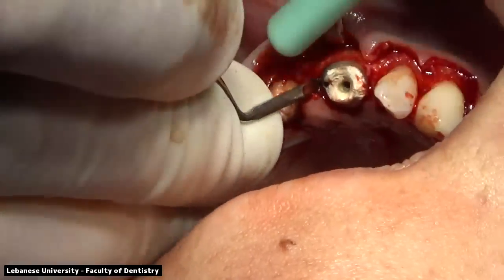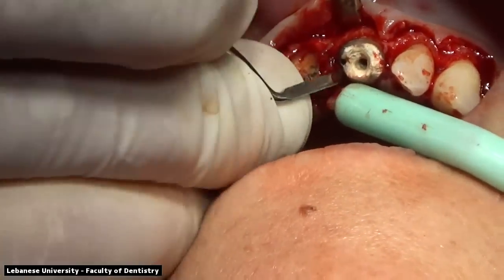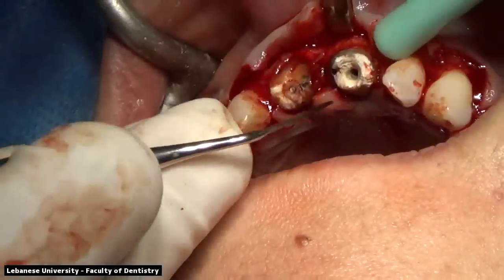The importance of the periotome is to remove any soft tissue adherences and any periodontal tissue attachments all the way to the apex of the root, so that we do not use too much pressure on the buccal and the palatal plates of bone.